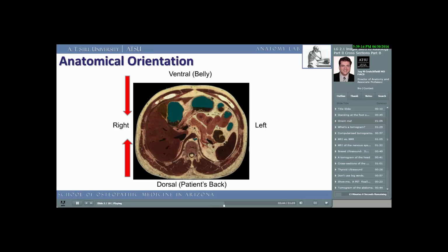Remember, the patient's right is on your left. If you ever watch episodes of Scrubs or Grey's Anatomy, or for that matter, most any other medical show except for ER, which always gets it right, whenever they hang x-rays, they're usually hung backwards, upside down, everted, just wrong. You won't make that silly mistake if you follow these rules.